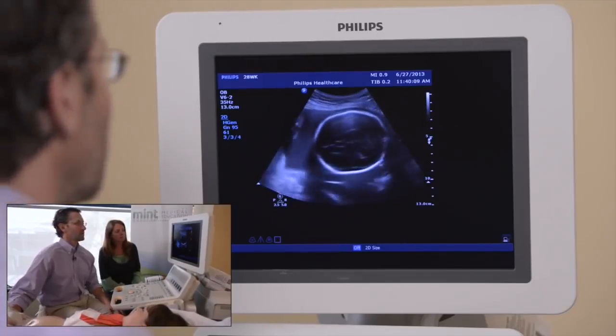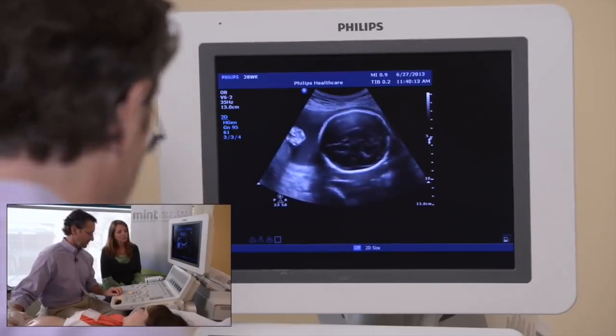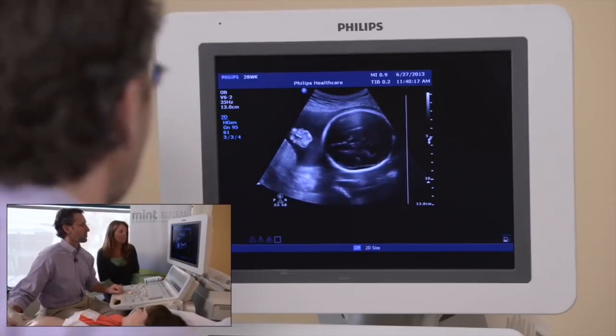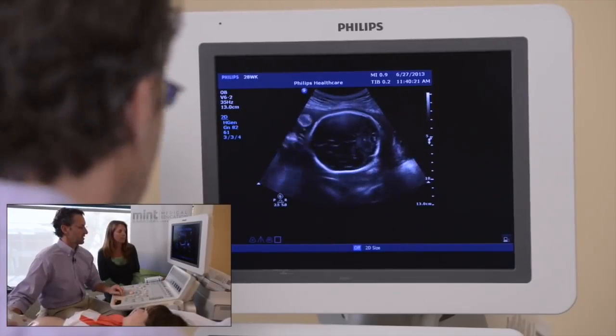And then we're going to just start with a generalized overview of the anatomy. We'll just go from head to foot and talk about whatever comes up. And Michelle, if there are frequent questions that you come across in your classes, then you can let me know.